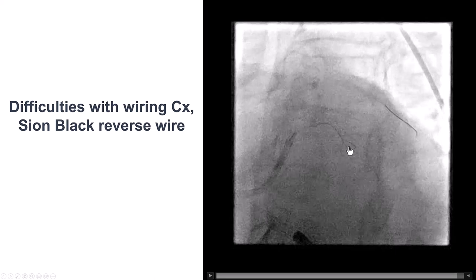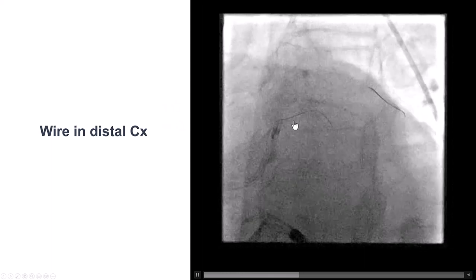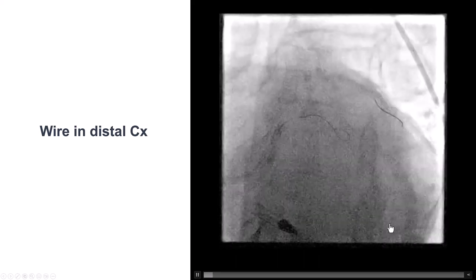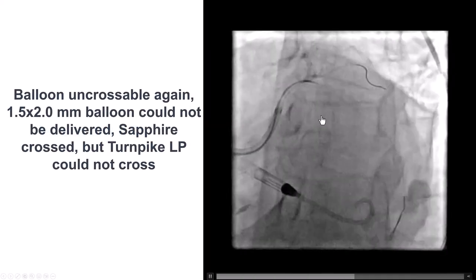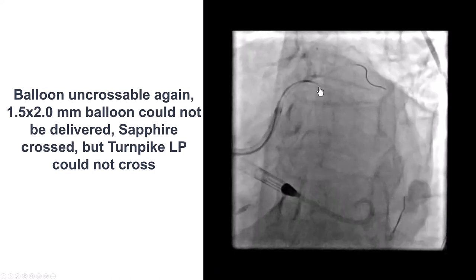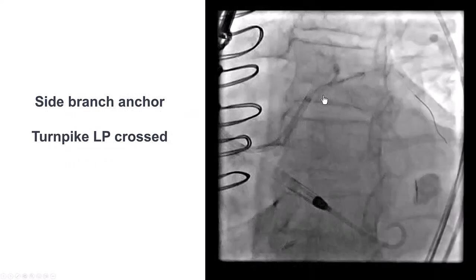After the wire entered the circumflex, it can be difficult to advance the wire further due to the kink produced. The next step was to use a single-lumen microcatheter to facilitate further advancement and exchange of the wire for a workhorse. Despite having the knuckle, the wire was manipulated back and forth and advanced down into the circumflex. However, the microcatheter would not advance and balloons would not cross. A Sapphire 1.0 balloon was used again but despite dilation, the microcatheter still would not cross.